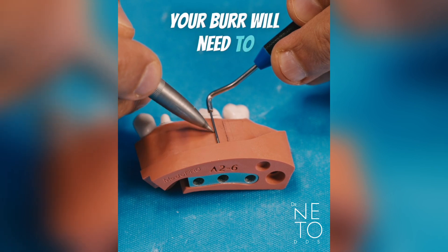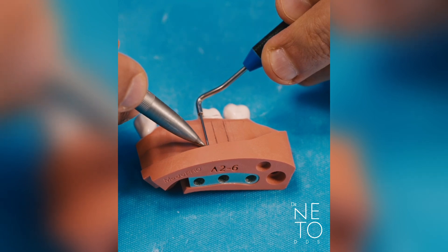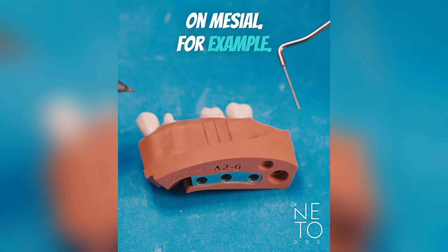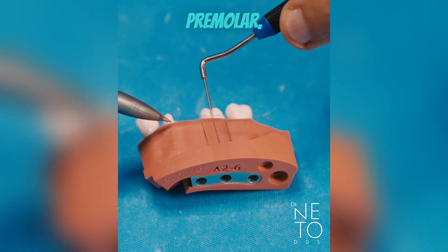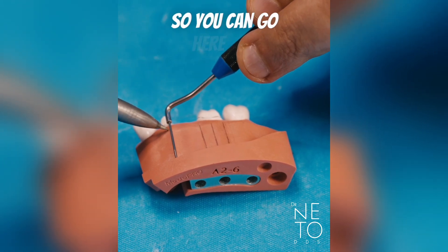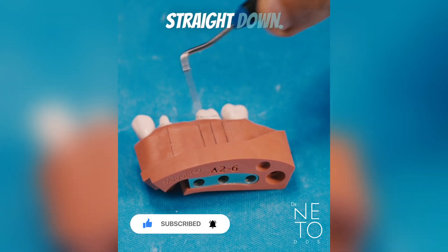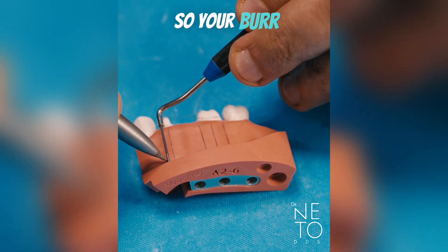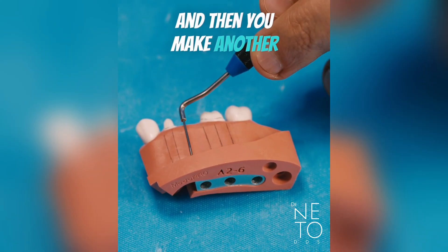Remember that your bur will need to follow that direction to prevent undercut or over-taper. You can make more lines — especially when working on the mesial — and make sure they are parallel to each other. For the premolar, there is a bump on the cusp tip that you can use as the long axis reference. Make a first line right in the middle straight down, then another one where you need to break the contact, and another one on top.